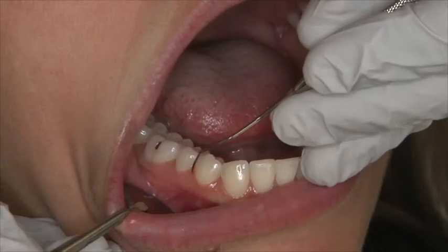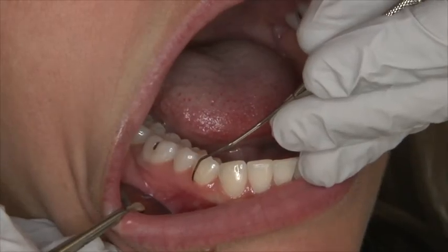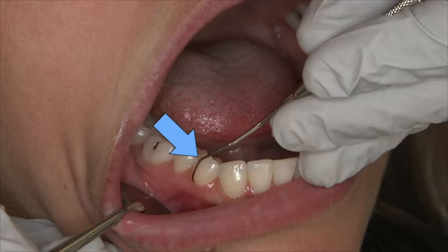To determine the correct working end for posterior teeth, place the instrument on a premolar. The lower shank should be parallel to the distal surface of the premolar. The last bend in the shank, also called the V, should be pointed towards the distal. The functional shank is positioned up and over the premolar tooth.